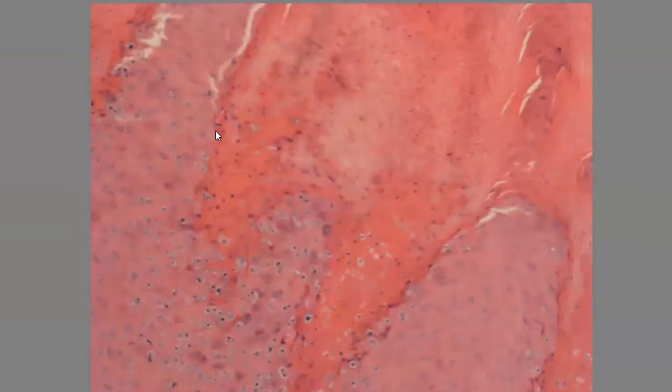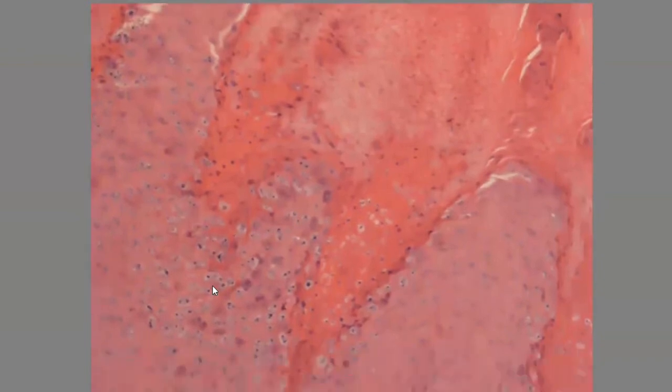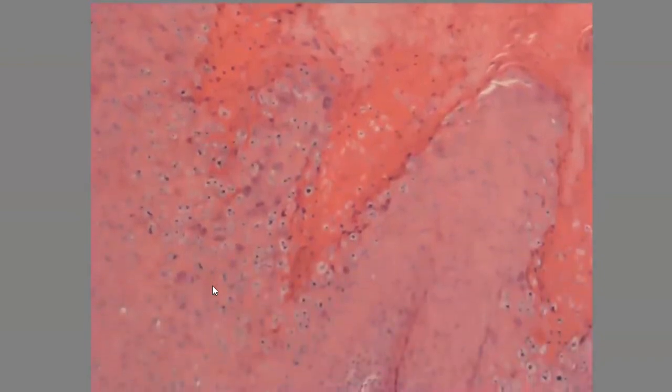So this is the 10x. Again, just to appreciate here the parakeratosis that is here, and also to appreciate these dense basophilic granules that are present in this layer of the epidermis. I will also show you some eosinophilic granules, but maybe it's more evident on higher magnification.